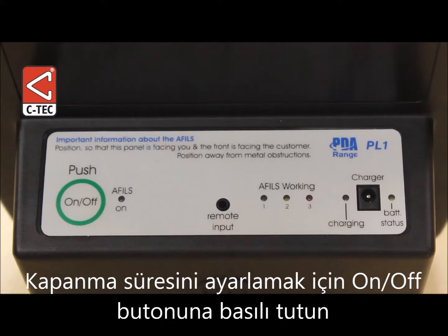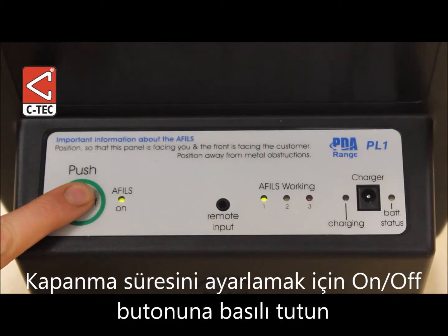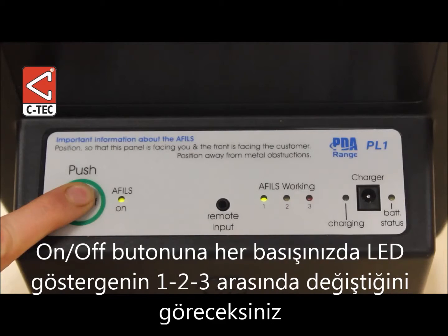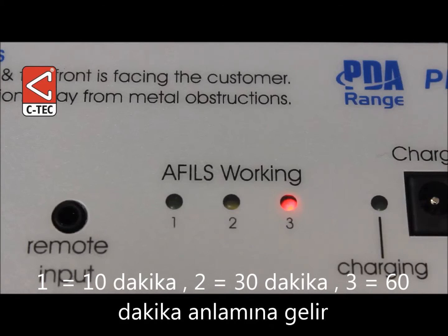To do this, make sure the amplifier is powered down and then press and hold down the on/off button and watch the AFIL working indicators step between 1, 2 and 3. Let go of the button when indicator 1 is lit to set the default time to 10 minutes. Let go when 2 is lit for 30 minutes, and let go when 3 is lit for 60 minutes.